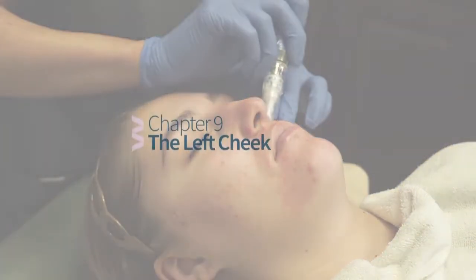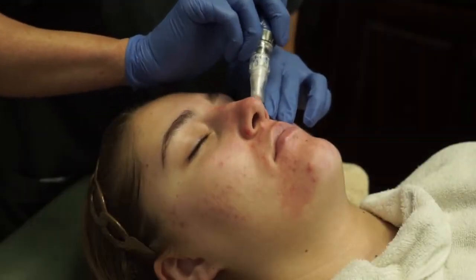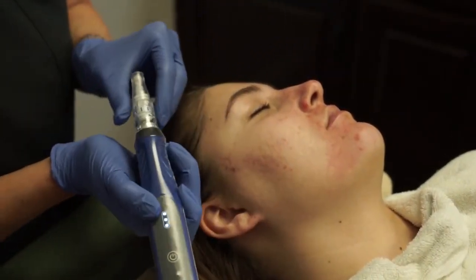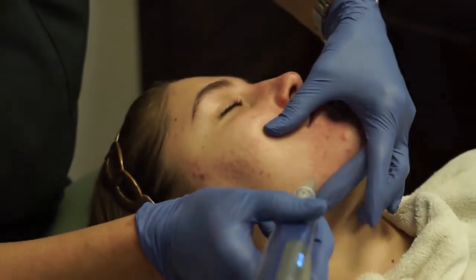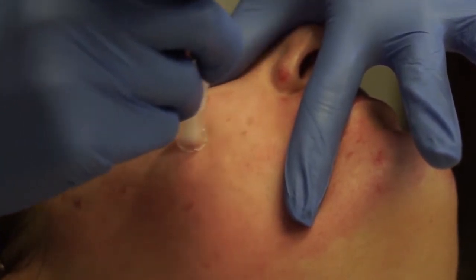The left cheek. Once the center of the face is complete, you will move to the left side of the face and subdivide the cheek. Prior to starting treatment on the left cheek, make sure to dial the cartridge to the same depth that was used on the right cheek. Notice, each line and corresponding click on the depth cup as you turn it equates to 0.25 millimeters.